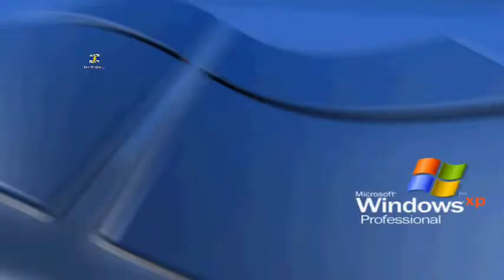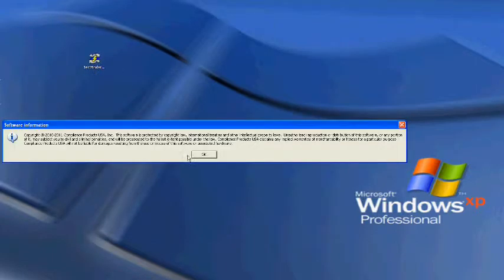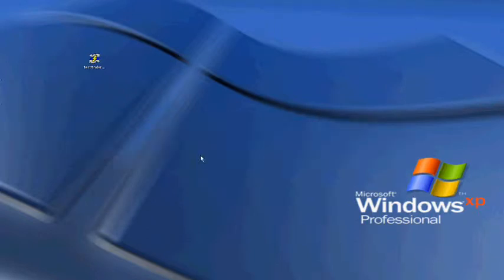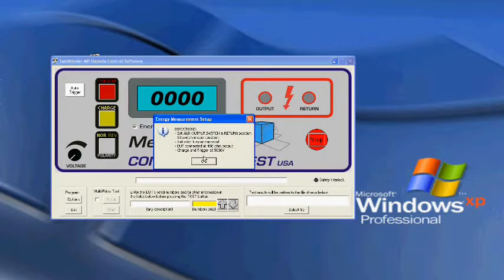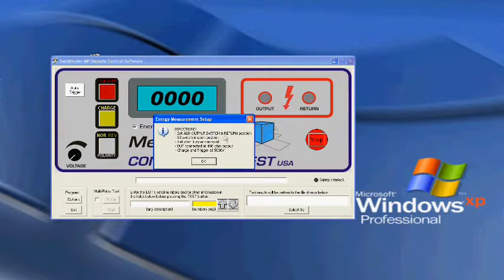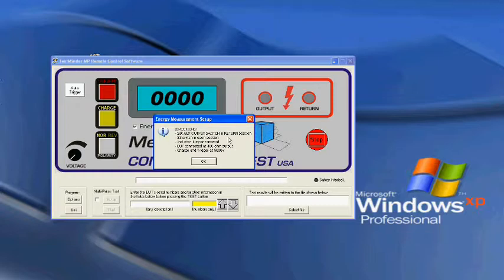If desired, this test can also be conducted by using the Compliance West Test Minder software for use on a 32-bit Windows computer. Select the Test Minder icon, open it, and enable the energy measurement. A dialog box describing the test will open. Read the directions and click OK.